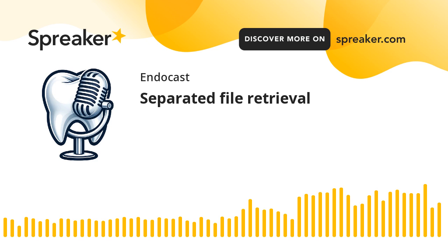So we have factors related to the operator, to the separated file itself, to the patient, and to the tooth. Because if I'm dealing with a case where a file is separated in a curved root and it's completely below the curve, the chances of retrieval are very low. Maybe you can go better for bypass. But if we have a file separated in a straight root, or even in a curved root and it is above the curvature, maybe you have a chance to retrieve it.